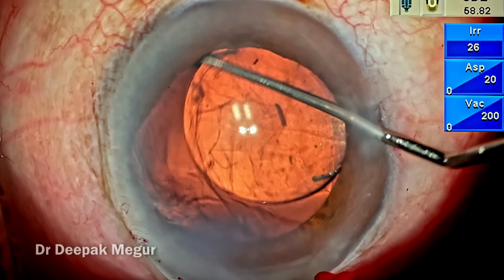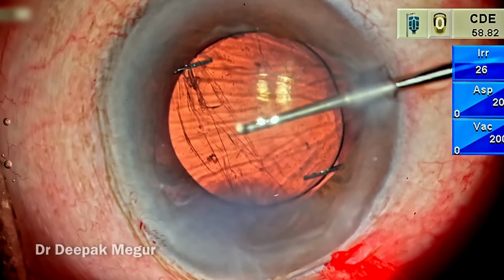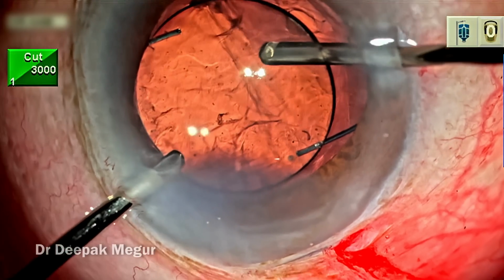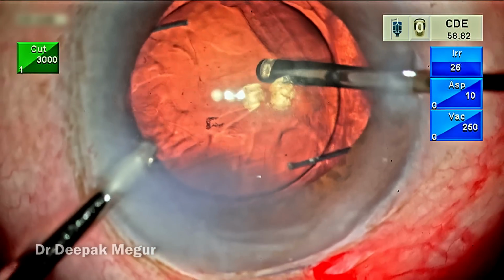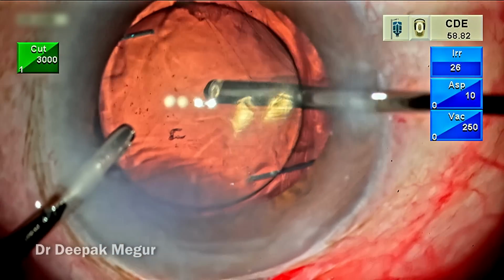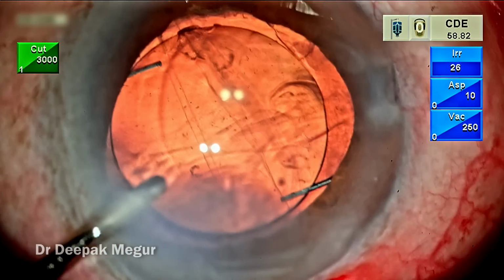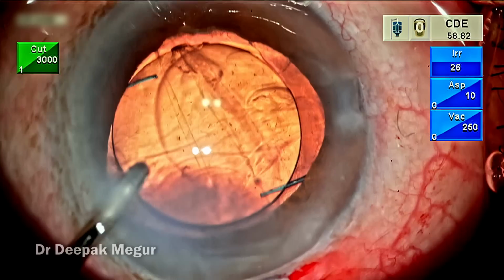So now both the haptics are in the sulcus, and the haptics are away from the area of the anterior capsular tear. So I thought, let me go in with the vitrector itself and do the anterior vitrectomy. I'm assuming that there is prolapsed vitreous there. But as I go in, I realize that there is still no vitreous. Again, I was surprised and taken aback, and then the entire posterior capsule unfolds and looks fine.